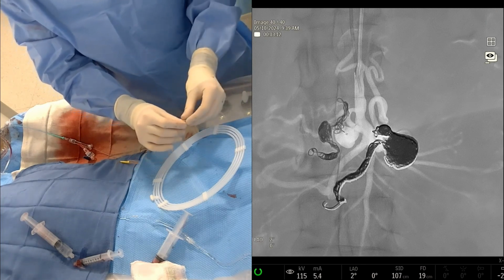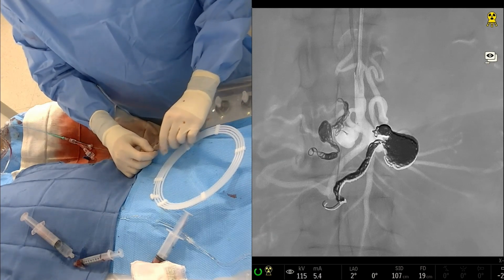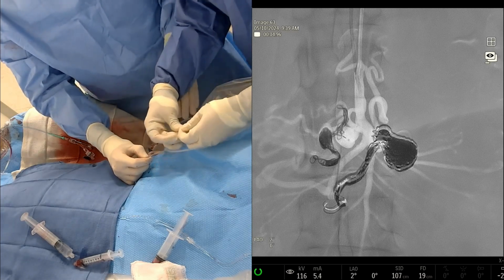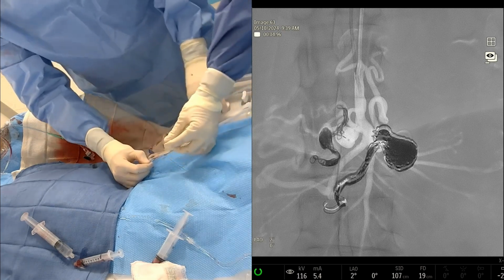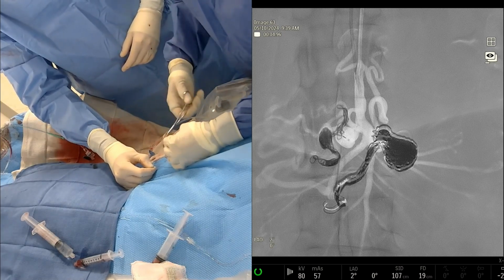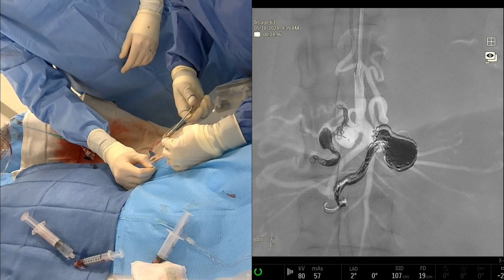When we used to use Interlocks in these high flow catheters, we would have a very difficult time pushing them through. They were really not intended to be used through an 027 catheter. This coil platform is great because you don't notice a difference depending on which catheter you use. It's a remarkable bit of engineering because you'd think it would be too small for one catheter and too big for another, but it seems to be fine in both.